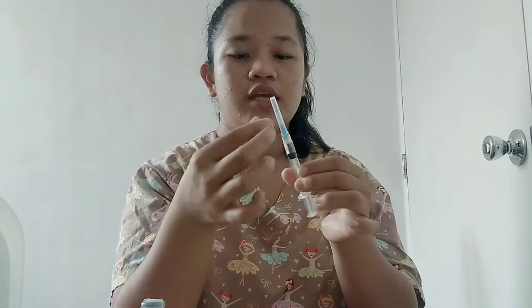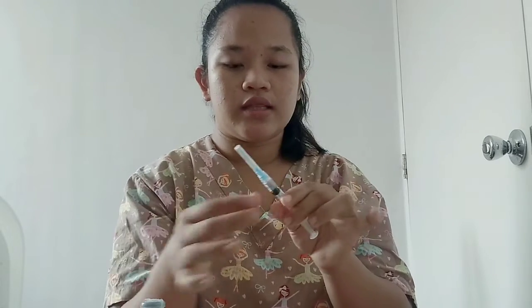Make sure that the needle and the syringe are connected properly and that it is not loose.